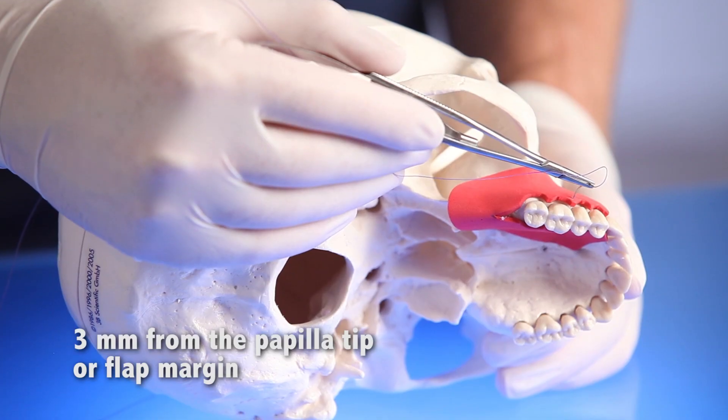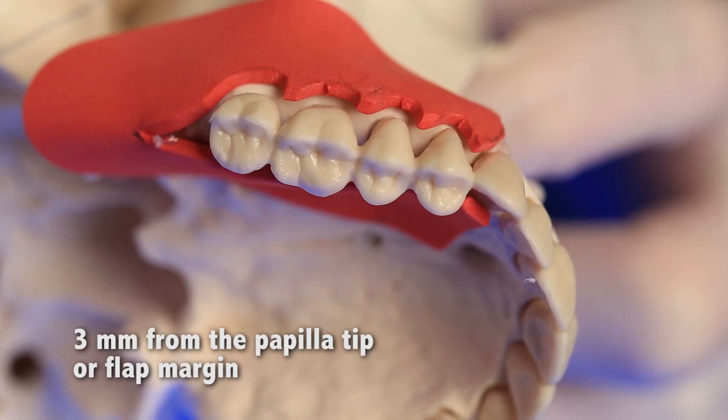Keep these general principles in mind. Number one, make sure the needle penetration is at least three millimeters from the edge of the flap or the tip of the papilla.